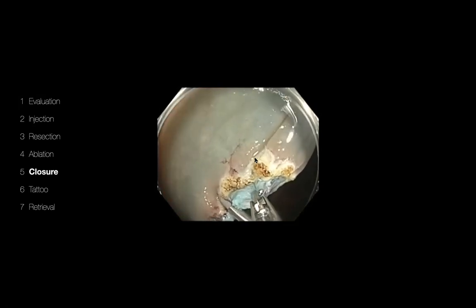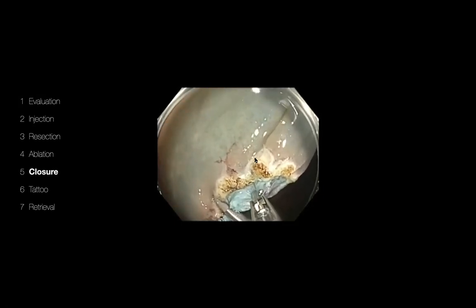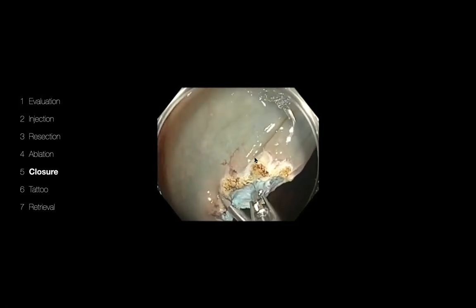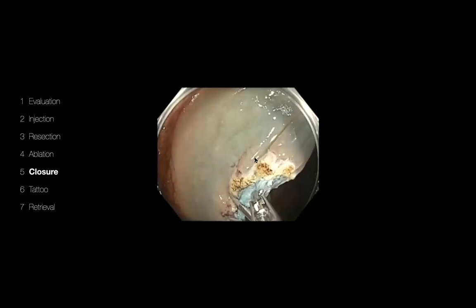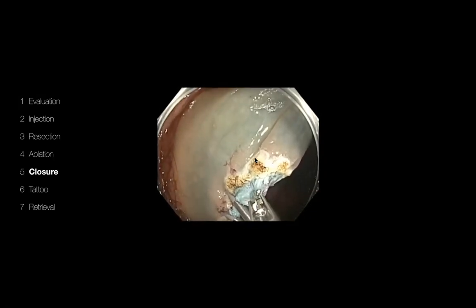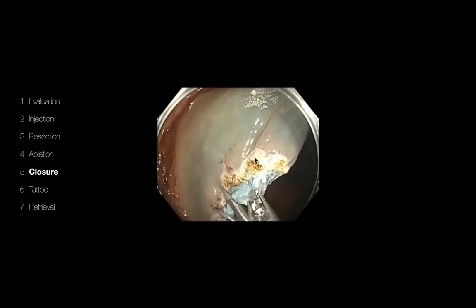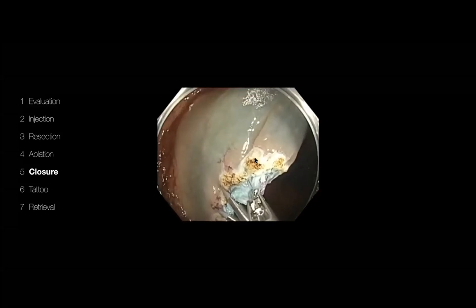So the reason why I want to make this point is that anybody using electrosurgery should be able to quickly change the settings. As you can see here, by this time we should have actually soft coagulated and moved on with our clipping. Here I'm holding onto the forceps while my assistant is trying to change from APC to soft coagulation. In the process, we have to shut the machine down and restart it, and it does take time.